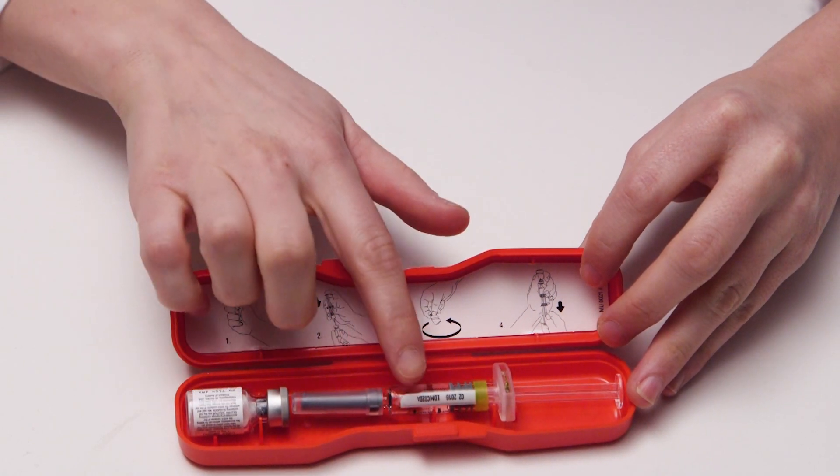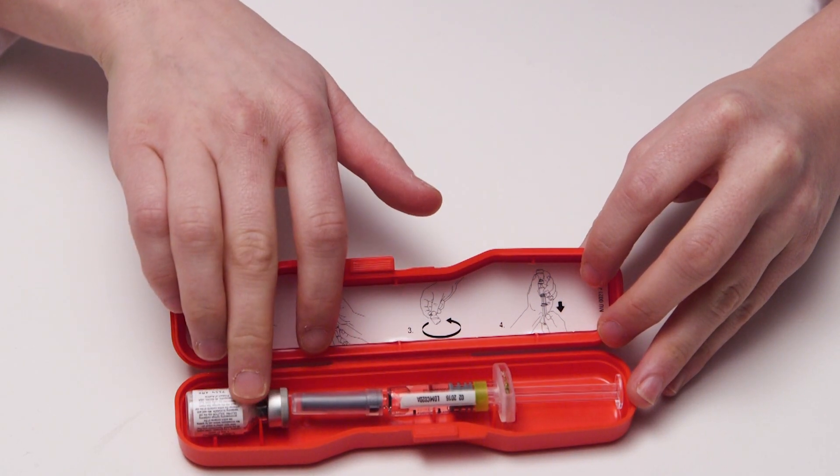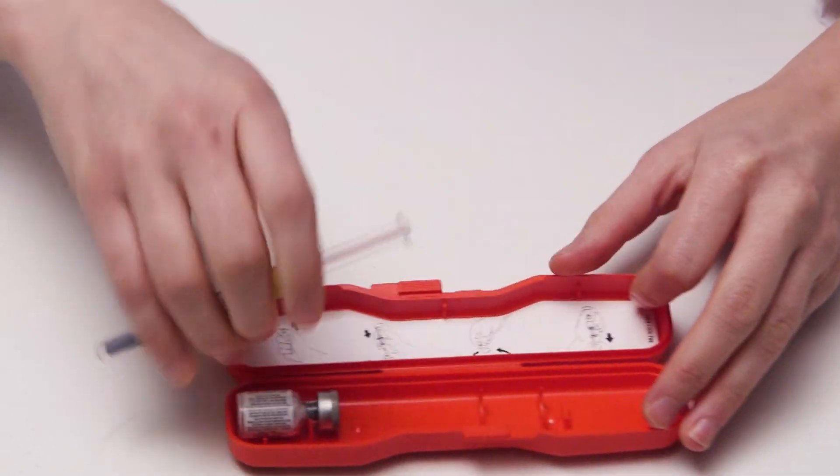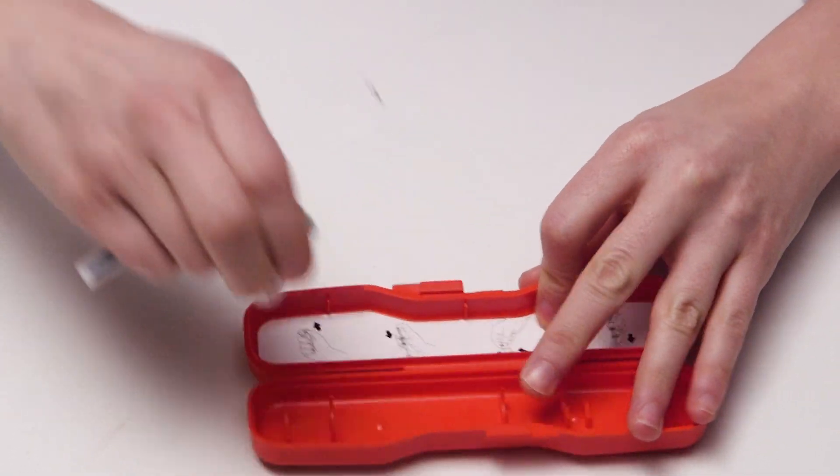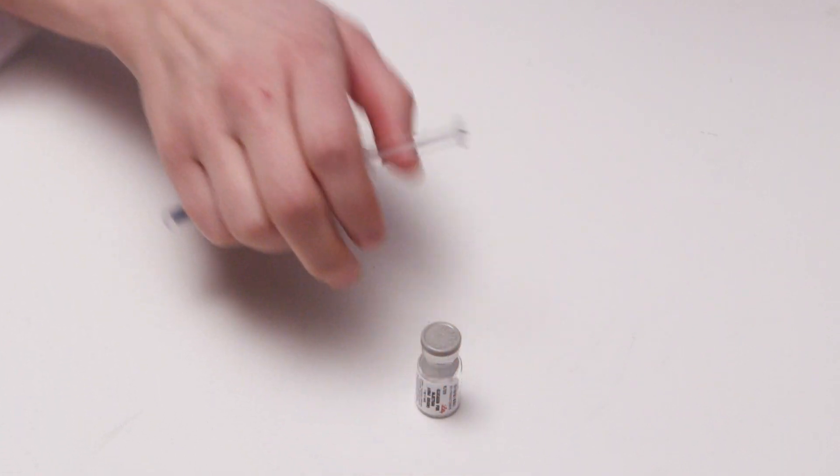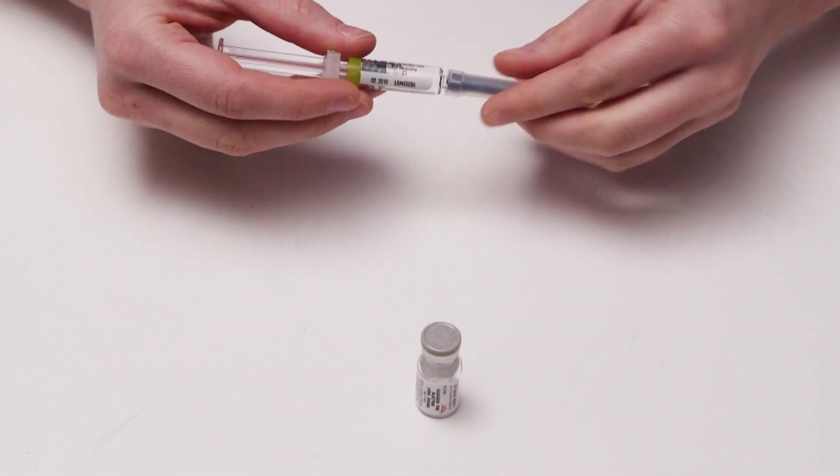You will need to inject the fluid into the vial to mix up the medication. To do this, set the vial on a hard surface and inject the fluid into the vial.